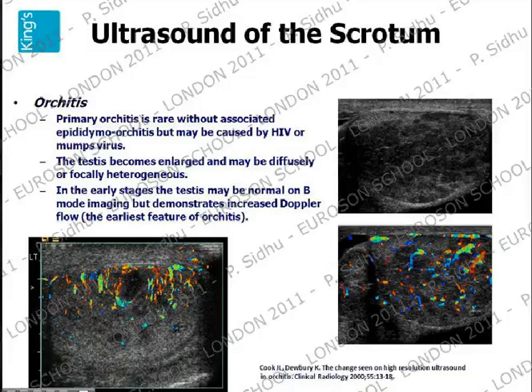And the same with other benign diseases. Orchitis can be a real problem in the testes. It can go to all sorts of bizarre abnormalities with focal areas of infarction. But importantly, sometimes it can give you this appearance of a focal mass.